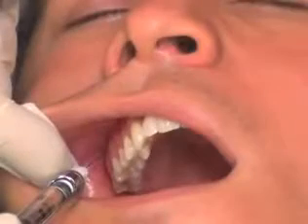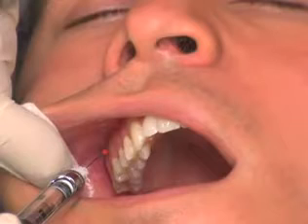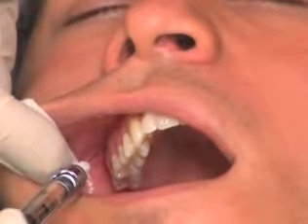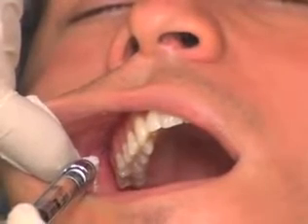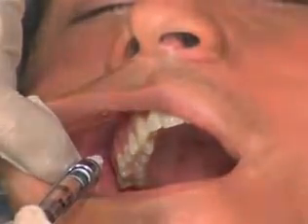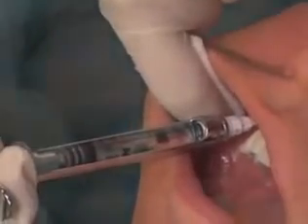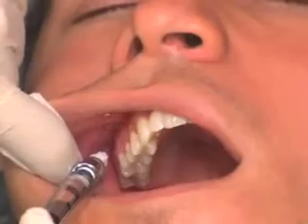The insertion site is at the height of the buccal fold adjacent to the maxillary second molar. The syringe is directed upwards, inwards, and backwards and is inserted to a depth of 16 millimeters. After two negative aspirations, half a cartridge of local anesthetic is administered over 30 seconds.